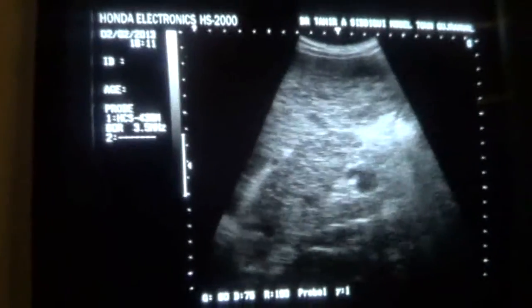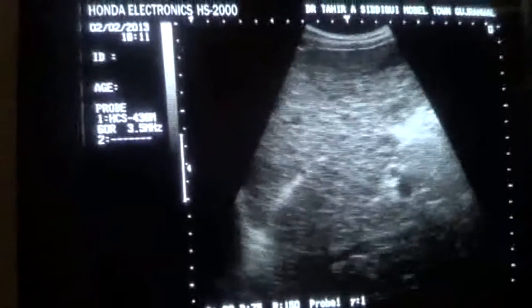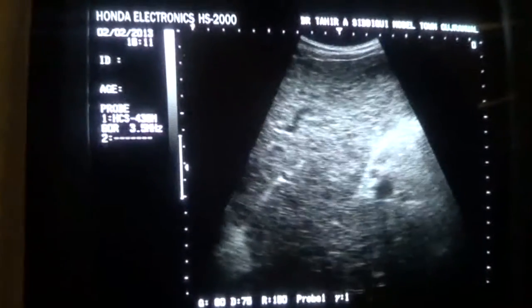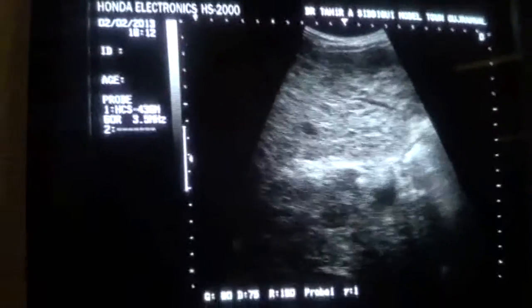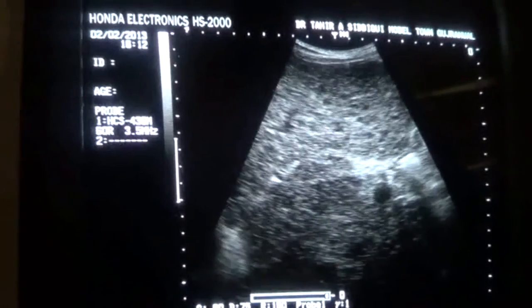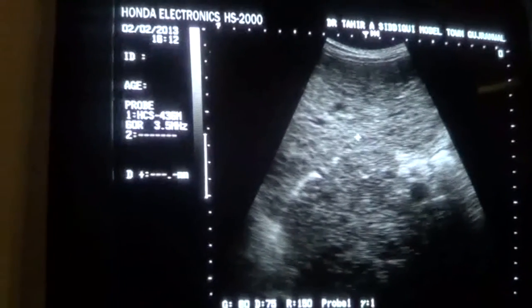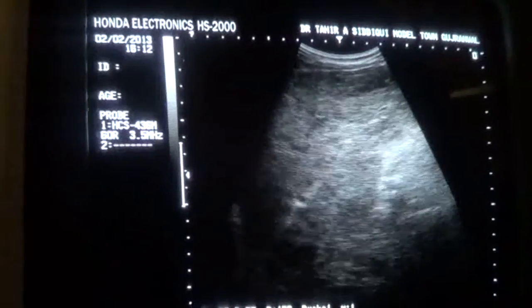This is a case study of a cirrhotic liver, and it shows you multiple hypoechoic, almost sub-centimeter focal lesions. In this view, you are seeing sub-centimeter focal lesions, hypoechoic. This one. Let me make it more clear.